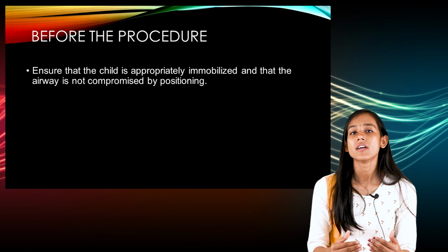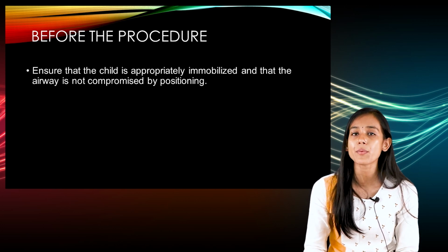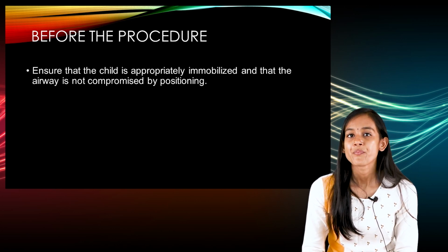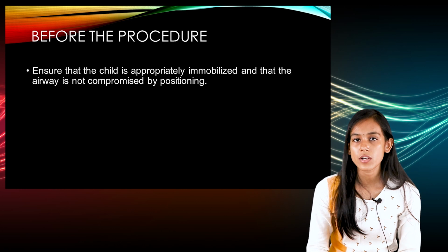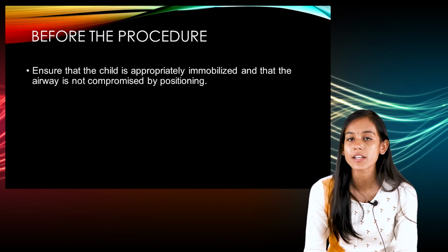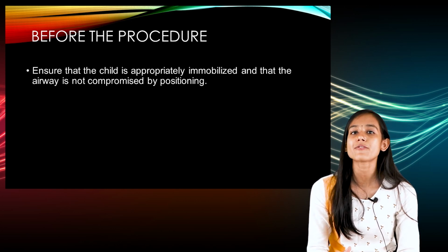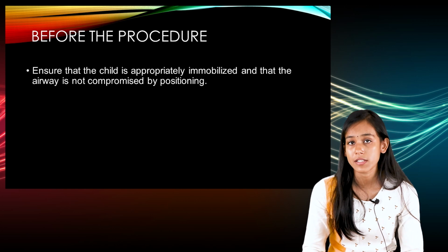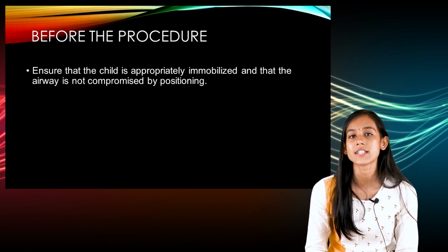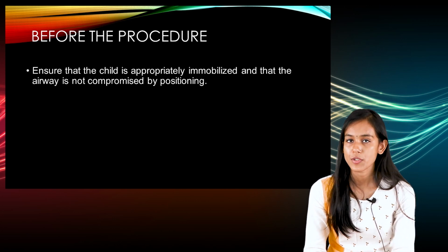So when you are positioning your client, you have to make sure that the airway of the patient is not compromised, and also, as this might cause pain to the child because this is an invasive procedure, right? That's the reason you have to make sure that the client is appropriately immobilized, or else that might cause problems during the procedure.